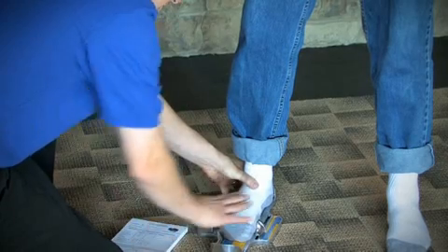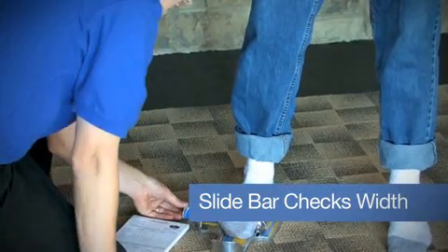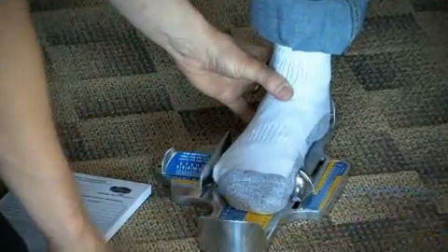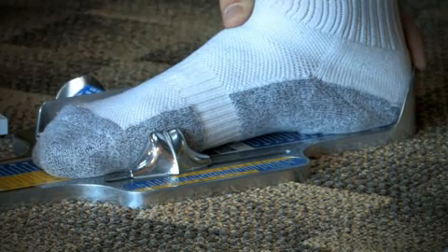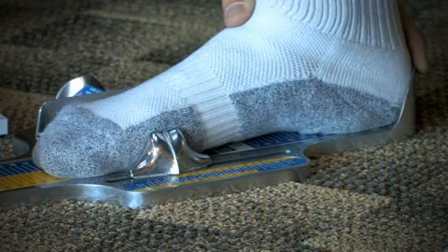Once we've gotten that measurement, we're going to take this sliding bar, which is checking for width, and we will come slightly over, just mildly touching the lateral portion, which is the outside portion of the foot. I just press down a little bit to give it a little more room. Using that midpoint calculation, we take the 10 and find that he is a medium.